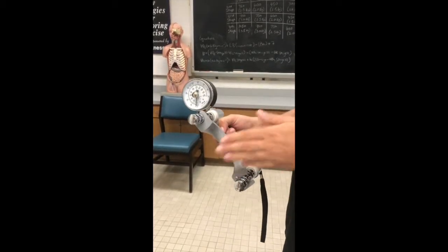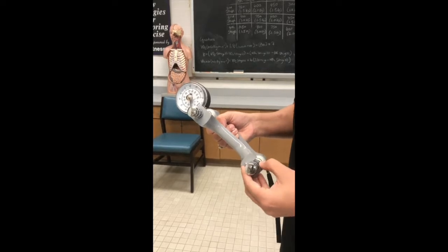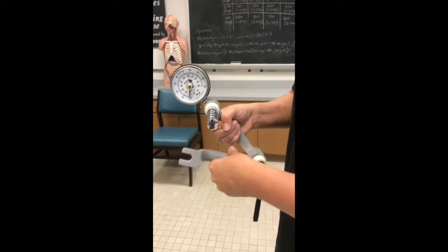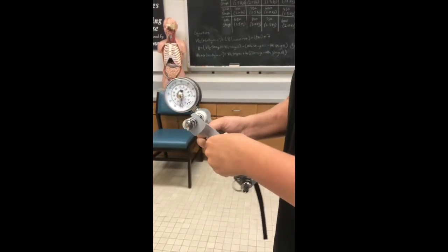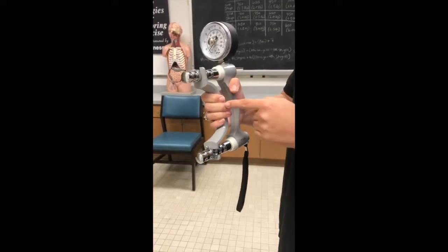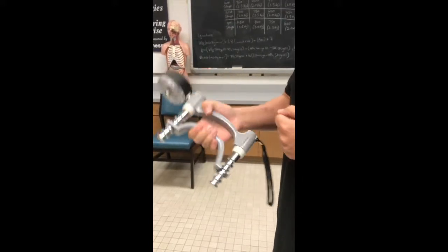We can move the handle based on where you need to have it. You can unlock it, take it off, put it right back on, and lock it back in. We want to make sure that the mid portion of your middle finger is at a right angle when using this device.